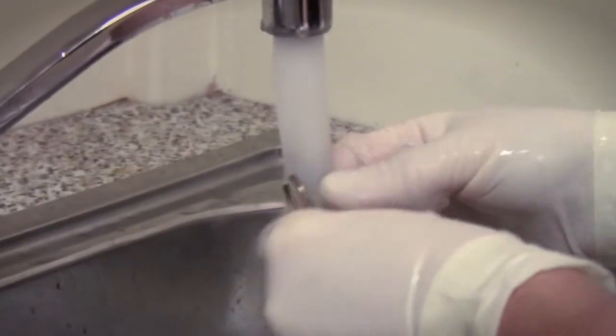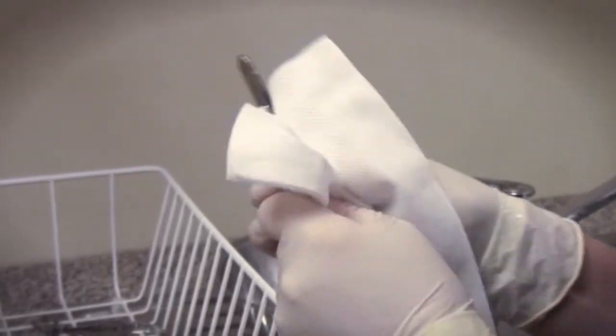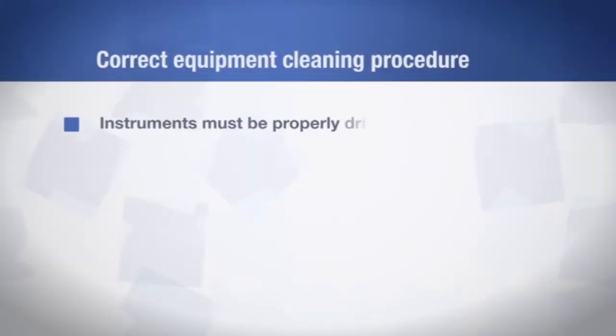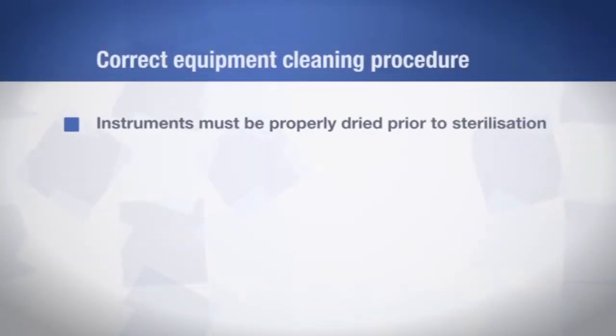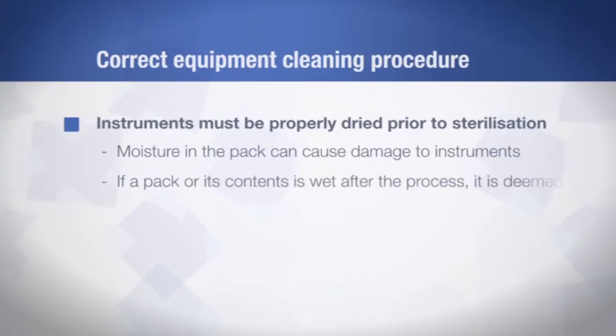Place the equipment in the sink and make sure to wash all surfaces under water to minimise the generation of aerosols. Rinse in warm to hot running water. All items should be dried with a lint-free cloth or in a drying cabinet. Your instruments must be properly dried prior to sterilisation — moisture can damage your instruments, and if a pack or its contents are wet after sterilisation, the pack is considered unsterilised and must not be used.